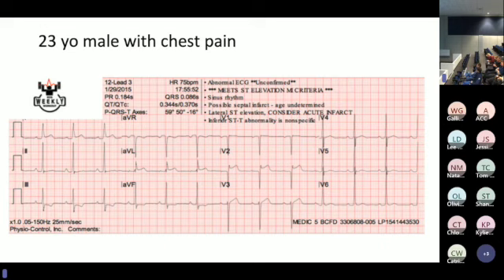So I guess you're also going to judge it on the patient, their clinical story, how they look, what do we know about their background? Chris has some forensic suggestions anyway. And you might do some serial ECGs and find that there's not really any changes.